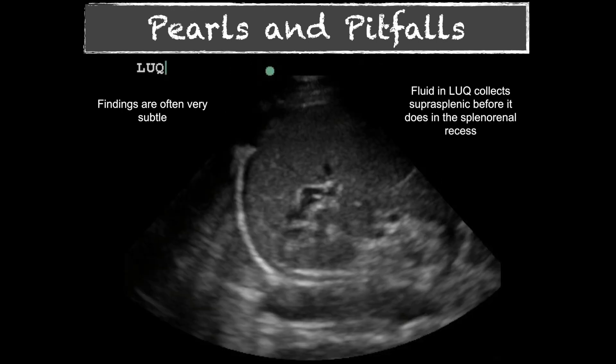Now let's look at the left upper quadrant, which is a little different from the right. In the right upper quadrant, the textbook shot is the hepatorenal space for fluid. In the left upper quadrant, the spleen really has to be bathed in fluid before you'll see fluid between the kidney and the spleen. The spleen is smaller, so it occupies less space and more fluid can collect there before you appreciate that space.